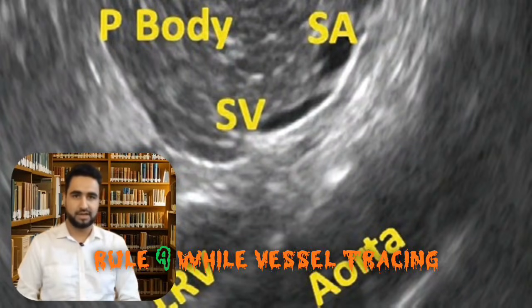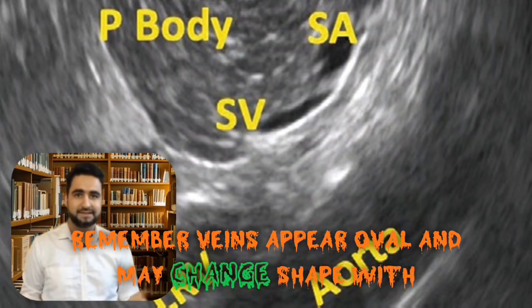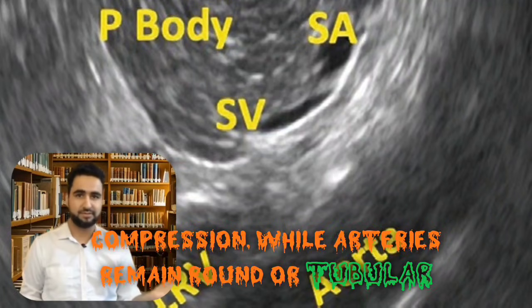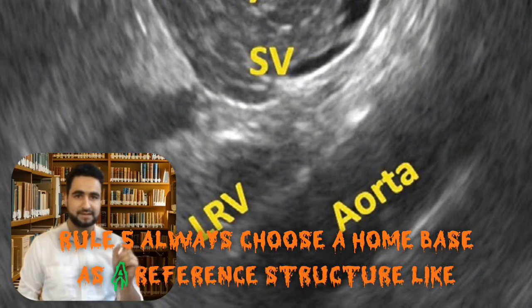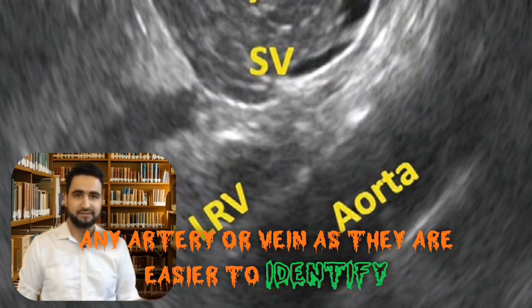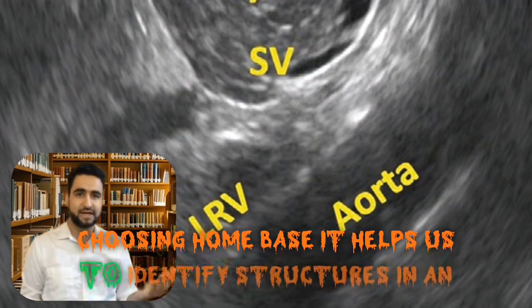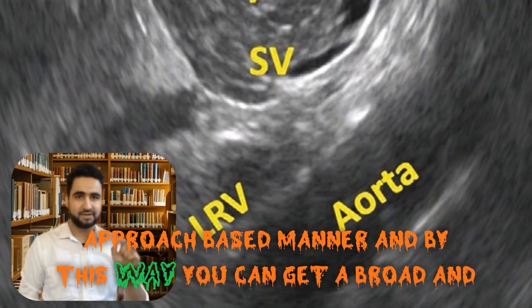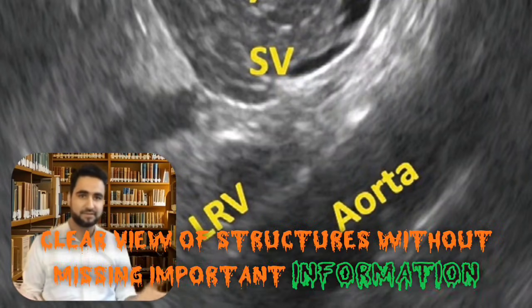Rule number four: while vessel tracing, remember that veins appear oval and may change shape with compression, while arteries remain round or tubular. Rule number five: always choose a home base as a reference structure, like any artery or vein, as they are easier to identify. Choosing a home base helps identify structures in an approach-based manner, giving you a broad and clear view without missing important information.